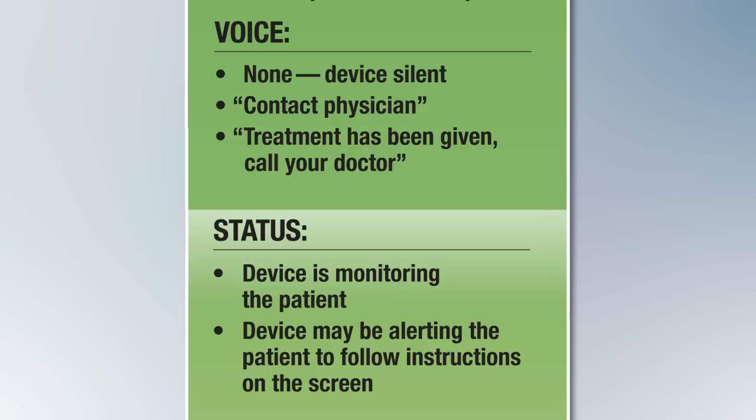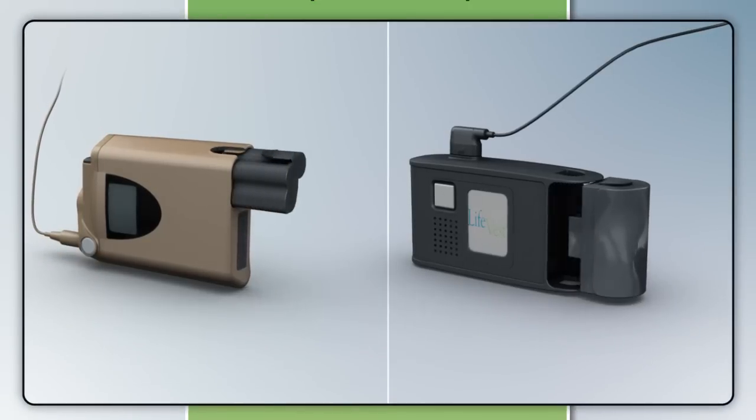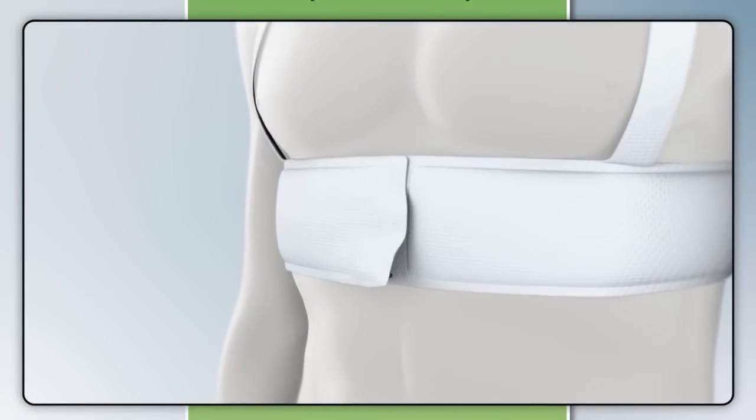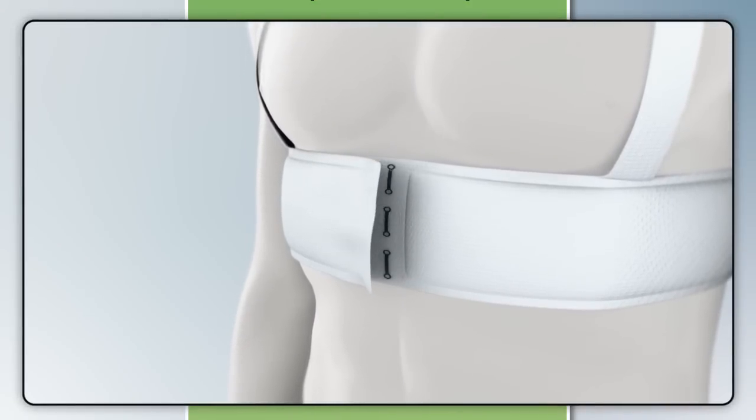In these situations, you should proceed with standard evaluation and treatment measures. If external defibrillation is available, a decision can be made to remove the LifeVest and monitor or treat the patient with your own external monitoring and defibrillation equipment. To disable the LifeVest, simply pull out the battery. You can then unclasp the hooks at the front of the garment and remove the device.